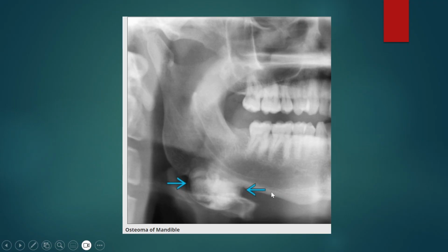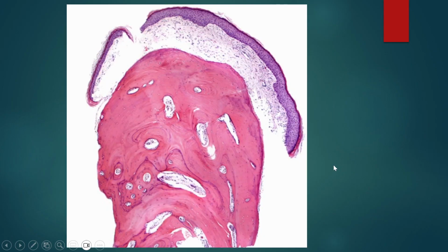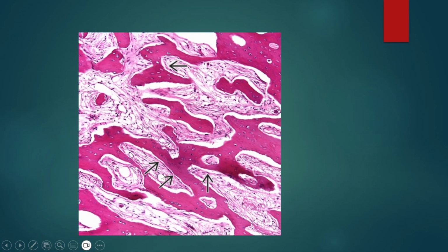This is the mandible. Then we can see this really nice mature lamellar bone. So that is forming this round area. So this is mature bone. And then this is the stroma I mentioned. You always need to focus on this area when you find this mature bone in the dermis. This is skin. So really hypocellular, loosely fibrous stroma. Here just shows some osteoblasts rimming around the bone, but nothing hypercellular. Just loosely fibrous stroma with this mature lamellar bone.